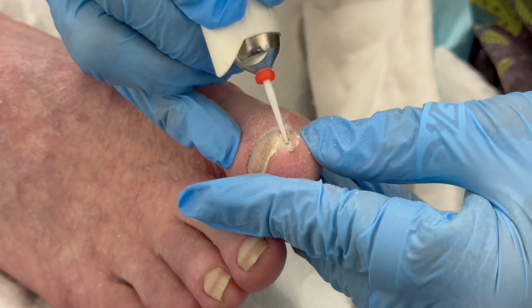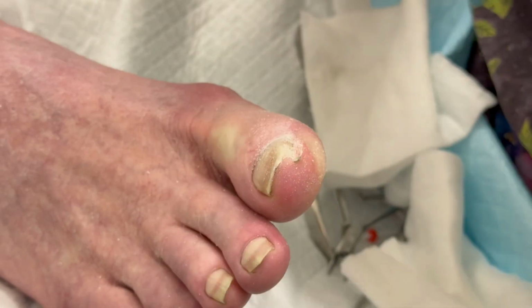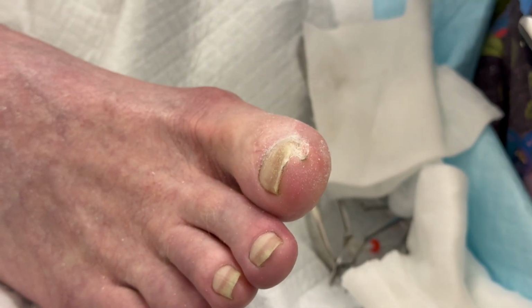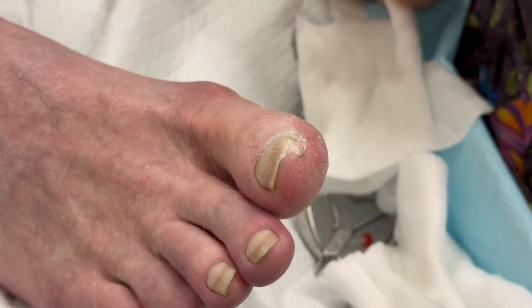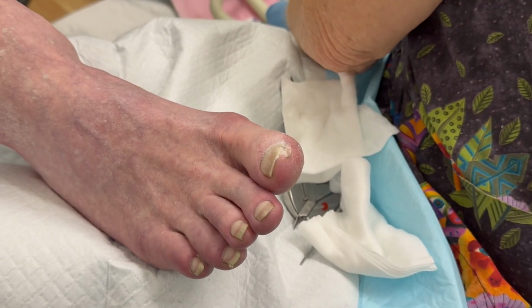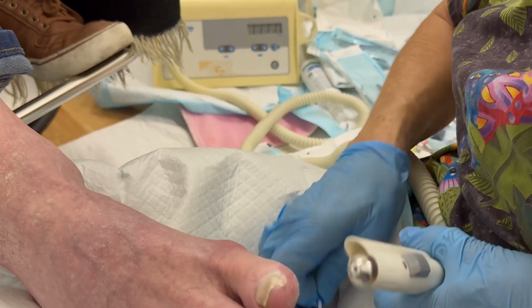Okay, so this one, and I did get that one little white spot, but I'm going to stop with this one. It is a little too pointy, but it's to show you what not to use. I do have one that's less pointy, but pointy nonetheless, which is, oh, that one's still pointy. Yeah, this one. Okay, the other one was more blunt at the top. Let me see the differences.